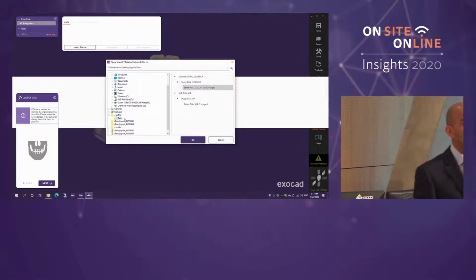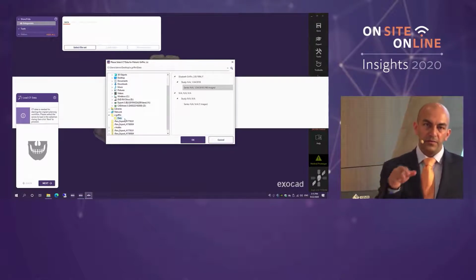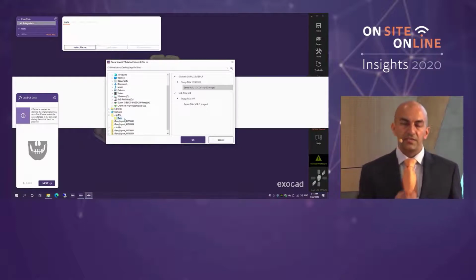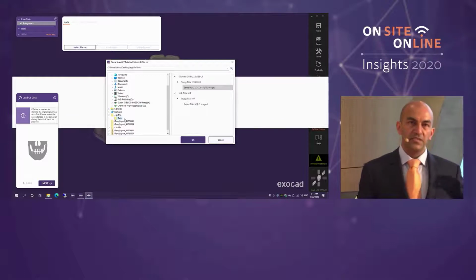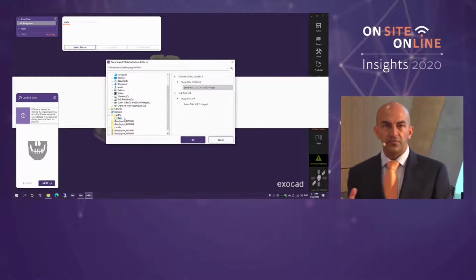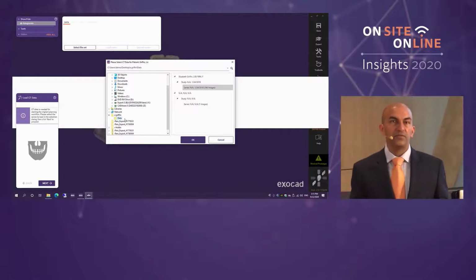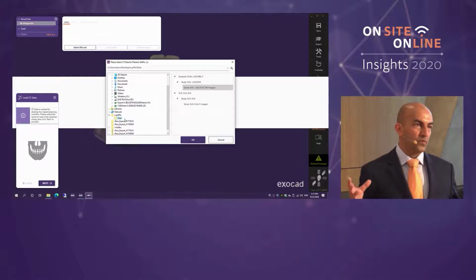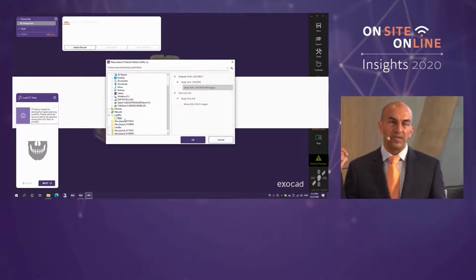One is that before you do a CBCT scan of a patient, look in the mouth, look at your proposed area and ensure that if there are lots of metal restorations around there, that you see if your CBCT software has metal artifact reduction. If it has, switch it on please. If it hasn't, you have no choice then but to raise the dose to the patient, because otherwise all of that dose gets soaked up by the metal and you have problems with planning.